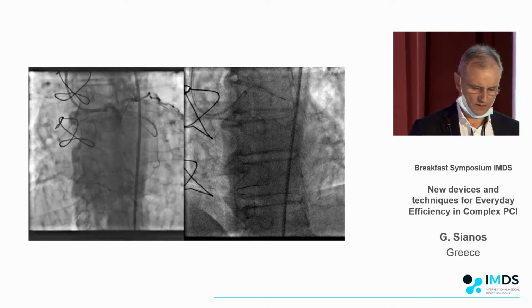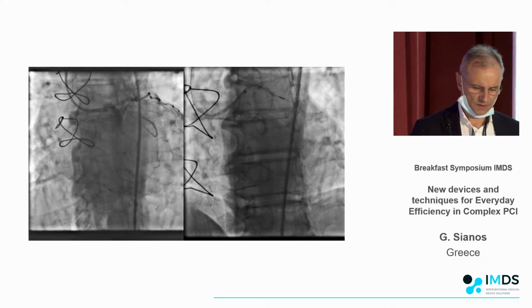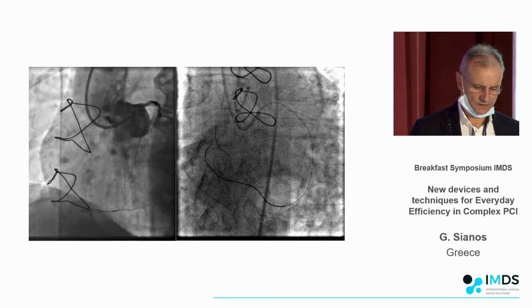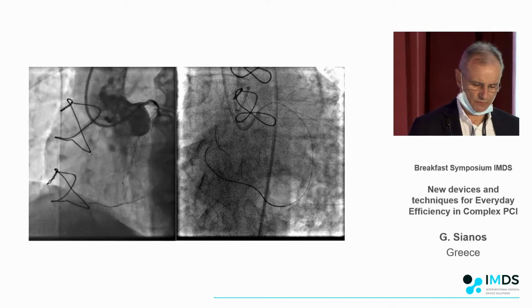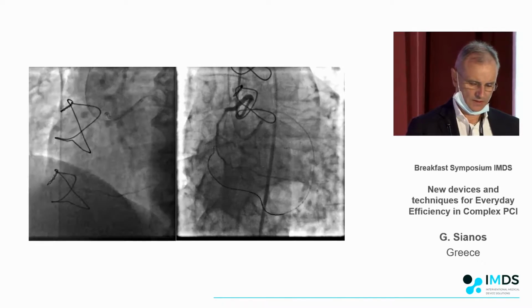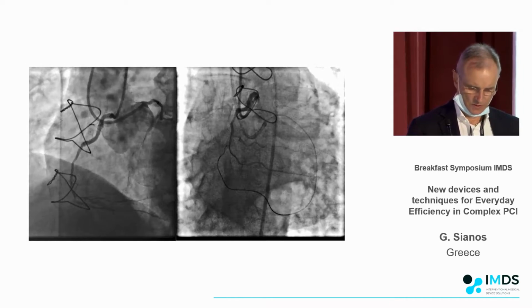That's another case here. Again, difficult patients, you will face them quite often. This was a right coronary that was occluded exactly after the takeoff of the RV branch, and you see that a retrograde access was applied directly. The proximal cap is somewhere here.